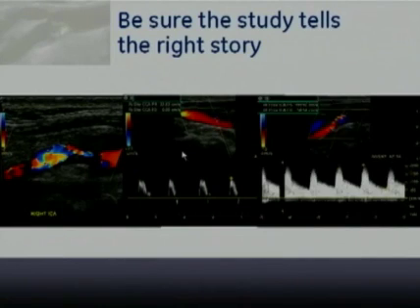And then the highest velocity she got as she sampled through the internal carotid artery was 200 centimeters per second. This could be right, but I'm suspicious that the velocity is probably much higher than that, because when I have such a low velocity common carotid artery with high resistance flow, I would expect an even higher velocity reading in the stenosis. And in fact, this area of stenosis looks to be much tighter than that.